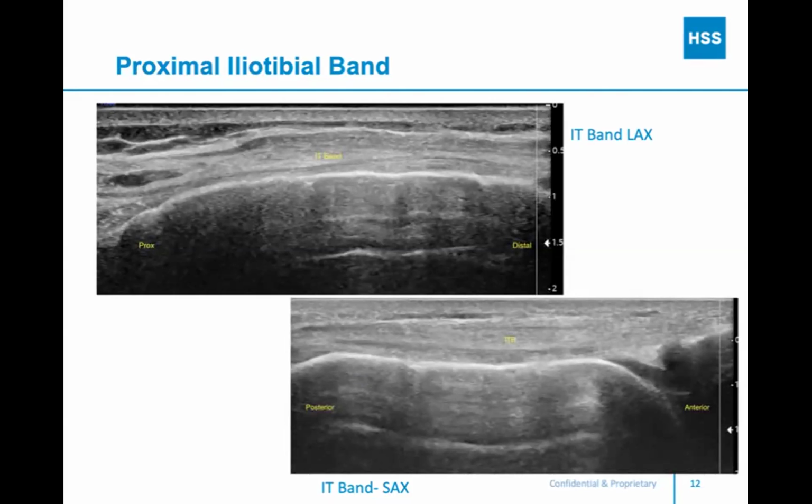And when people are in that supine position, any fluid that extends underneath the IT band and goes away when you put them in the sideline position is likely going to be related to that. Right where you have that ITB labeled in the center of the screen, that's maybe a little bit behind the anterior end of the ITB bursa.